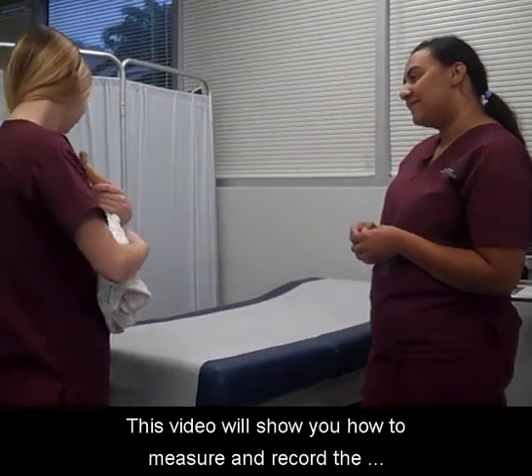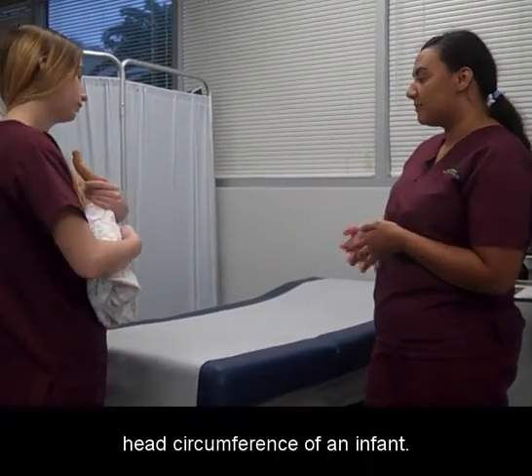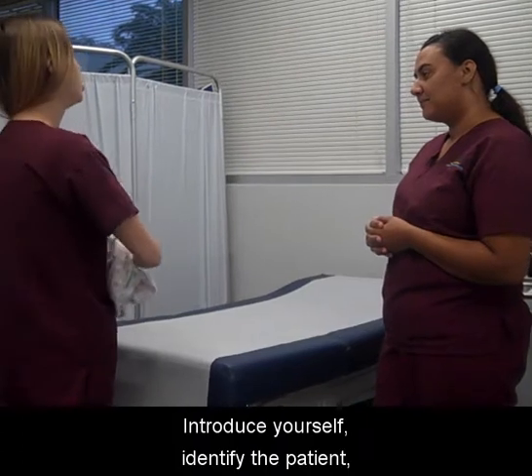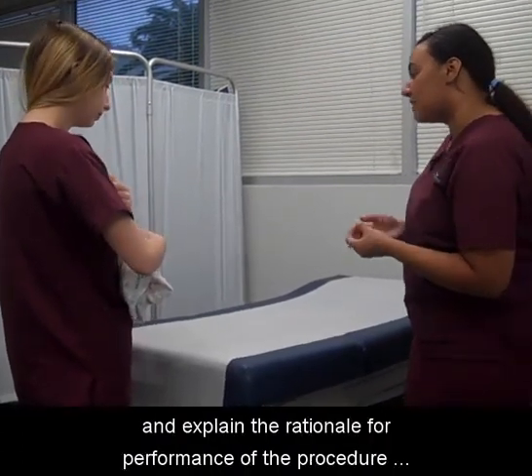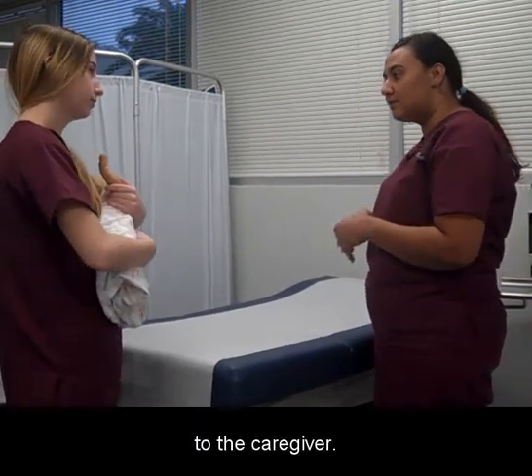This video will show you how to measure and record the head circumference of an infant. Introduce yourself, identify the patient, and explain the rationale for performance of the procedure to the caregiver.